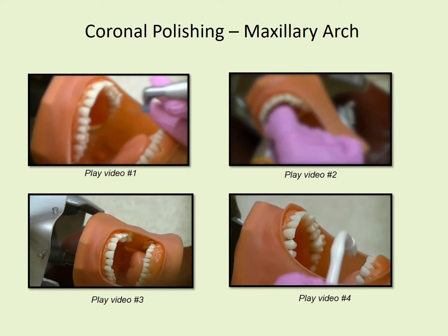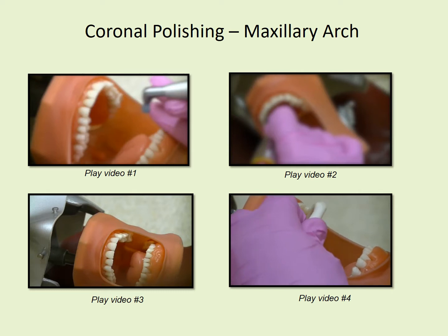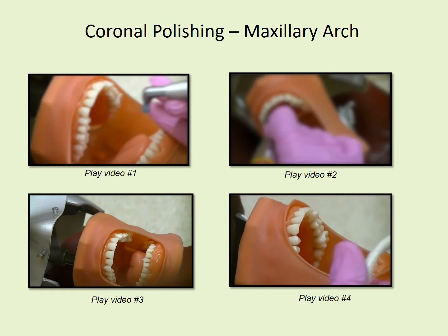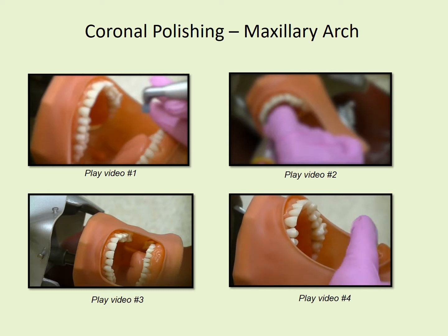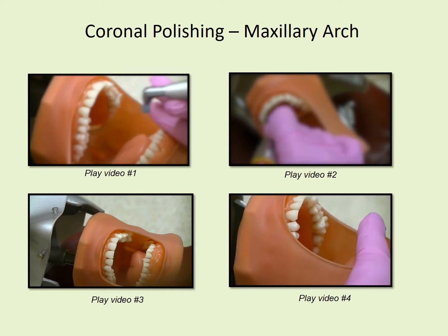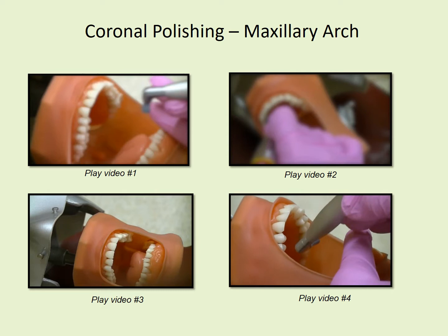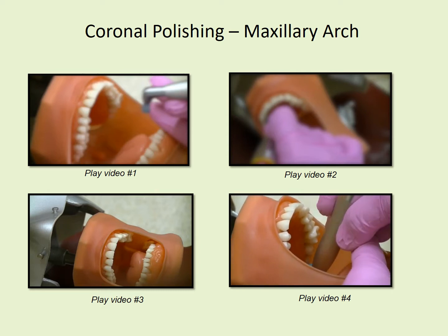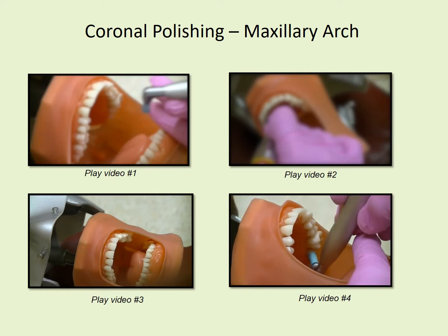So lingual of the second quadrant: chin down, head is turned away, 8 o'clock position. Suction, get your polishing paste. The index finger of your non-dominant hand goes across the lower anteriors, and your polisher built-up fulcrum is used.